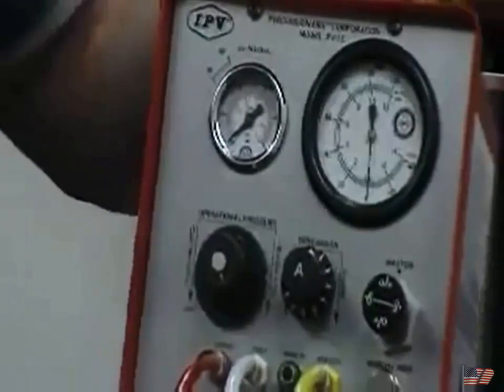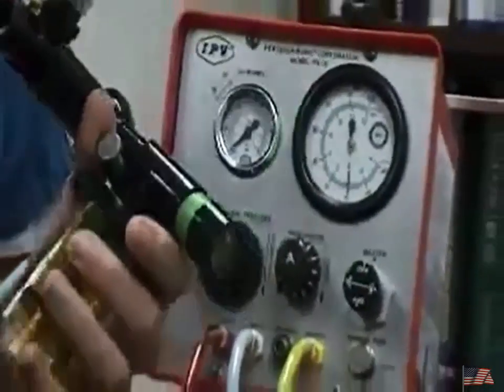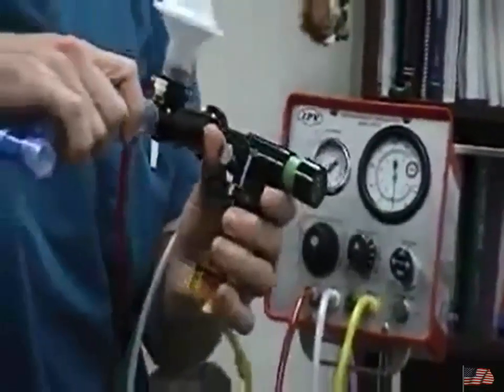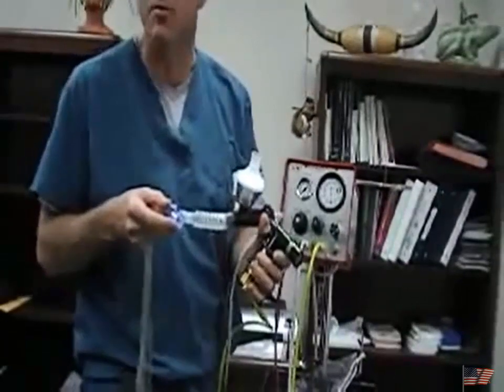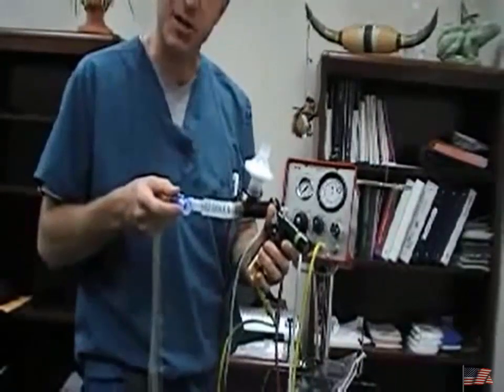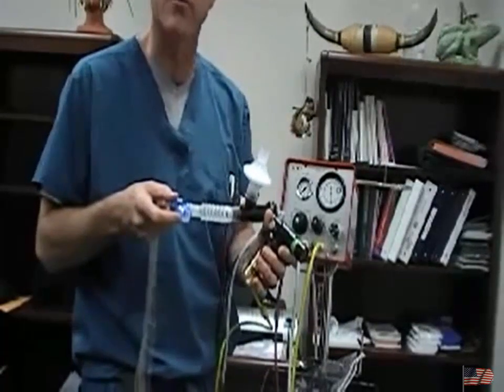Now what I'm going to also do is connect a closed suction system to here, and then this would directly go to my ET tube or trach tube. What I want to do is suction out the patient's throat, get any of those glottic secretions out of the way, because I want to deflate the cuff.